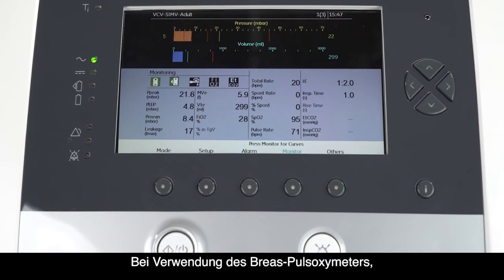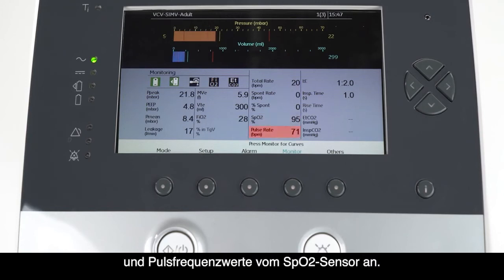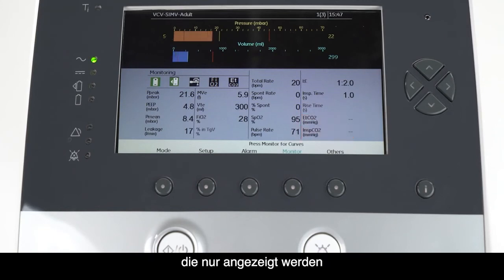If using the Breas pulse oximeter accessory, the final two readouts will indicate the oxygen saturation and pulse rate readings from the SpO2 sensor. The last column has an IE measurement, measured inspiratory time, and the inspiratory rise time. The final two readouts of this column are the end-tidal CO2 and inspiratory CO2, which will only be displayed if the end-tidal CO2 sensor accessory is attached.